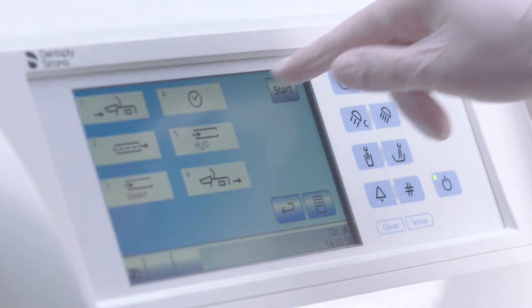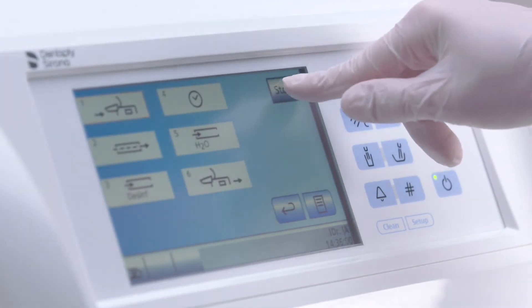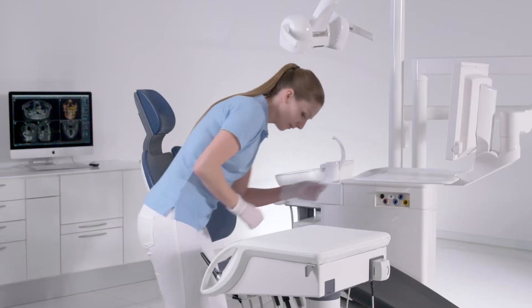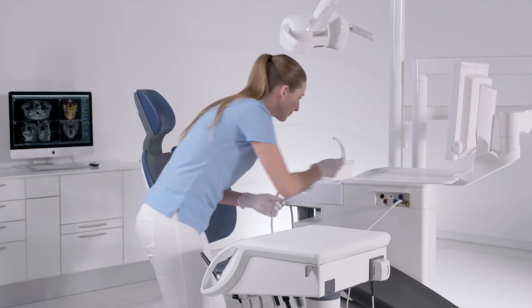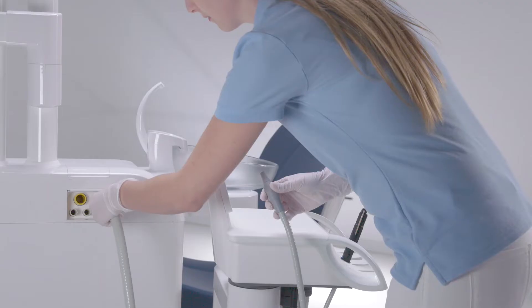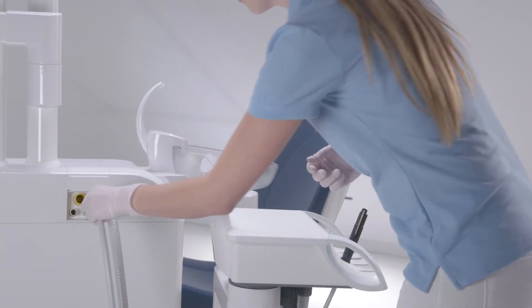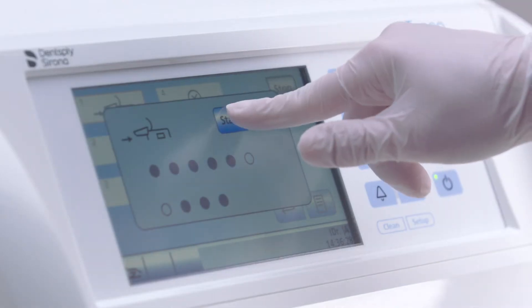Activate the function in the sub-menu of the Start dialog. Attach the instrument hoses of the dentist and assistant elements and the suction hoses to the designated adapters in the water unit, and then press Start.